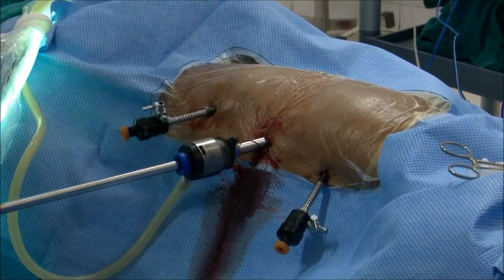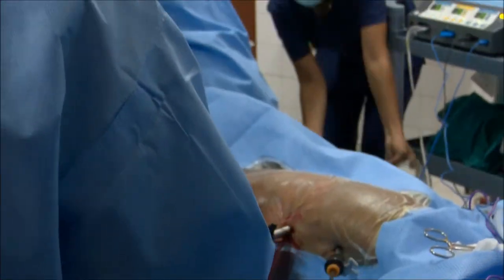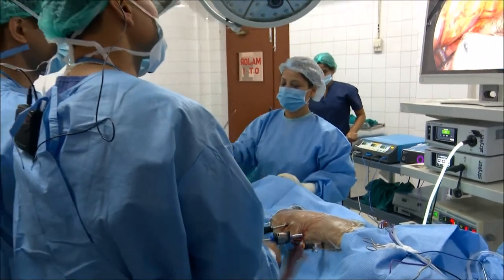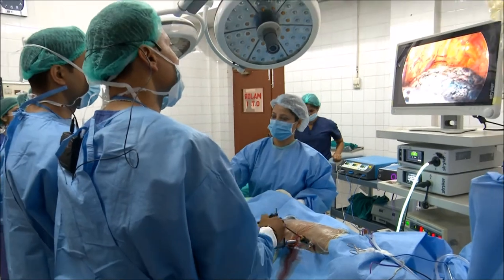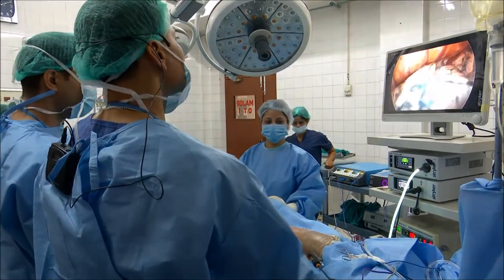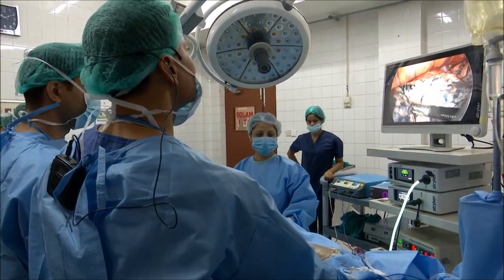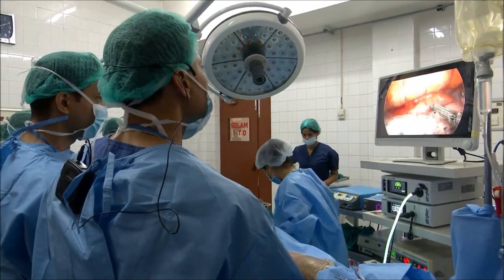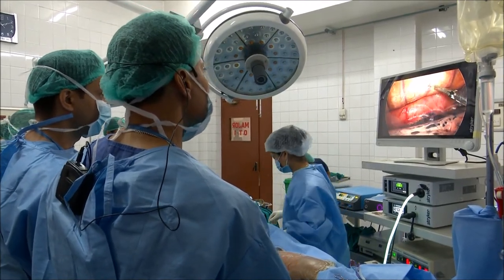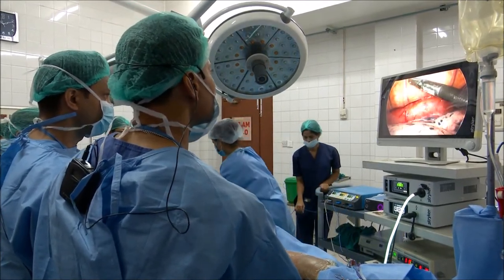So now you can see — this is the prone position. This is the lung. This is the upper lobe of the lung. This is the fissure you can see — this is the major fissure. This is the lower lobe of the lung. This is the vertebral border you can see here. These are the intercostal vessels, very well visible.